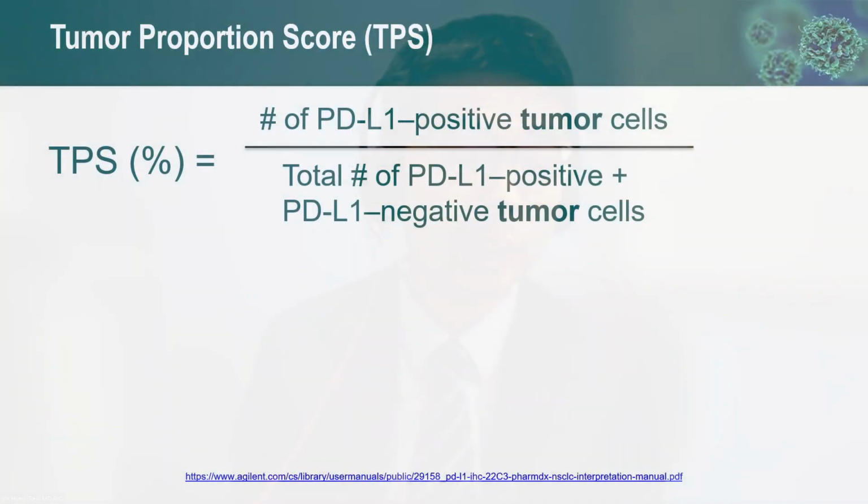But then I think the development of LDT in a way allows us a lot of flexibility. So in that sense, it was actually very powerful. So I actually do not think that in terms of comparing between LDT and companion diagnostic, that in that sense was limited. But in terms of PD-L1 testing in general, PD-L1 immunohistochemistry is a semi-quantitative biomarker, right? In the space of non-small cell lung cancer, TPS score 1% matters. 0.5 versus 1% is actually a clinical decision point, right? 40 versus 50% can be a decision point.